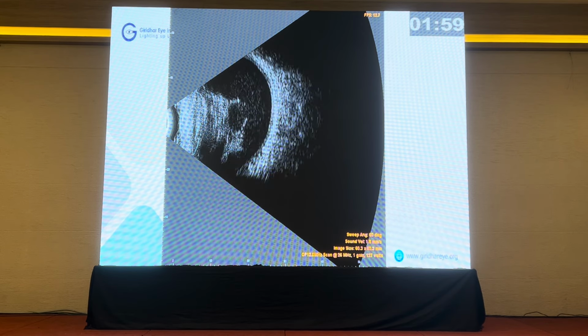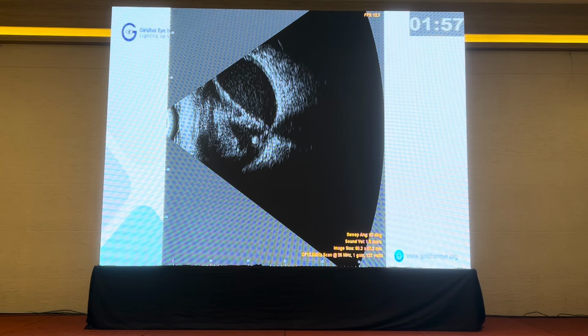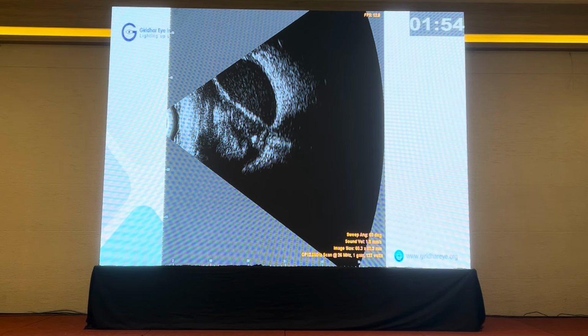And due to absence of view beyond the anterior segment due to bleeding, we could see a closed funnel retinal detachment and hemorrhagic choroidal hemorrhage surrounding the retinal detachment.